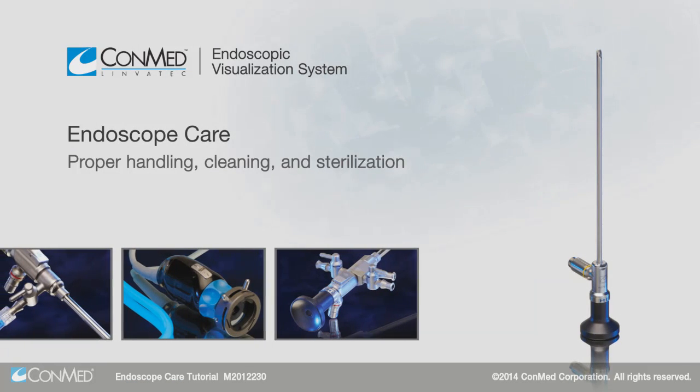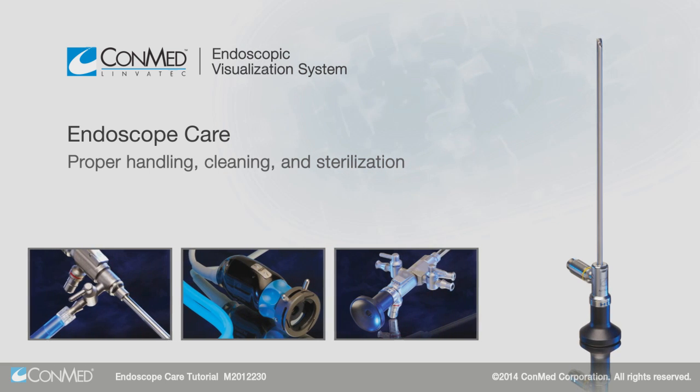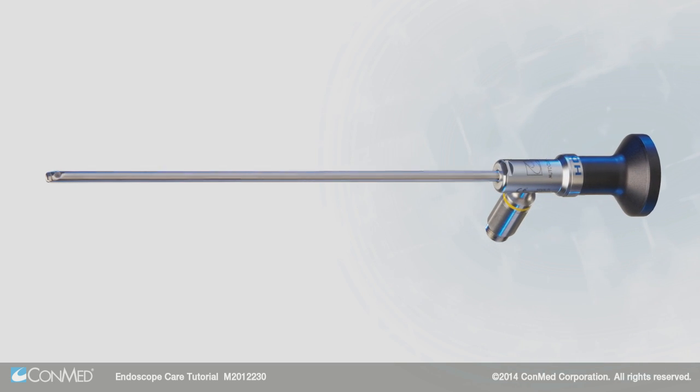The endoscope plays a large role in providing your surgeon with optimal visualization in a closed joint or cavity by transmitting high-contrast light to the camera head. First, let's quickly review the important components of an endoscope.